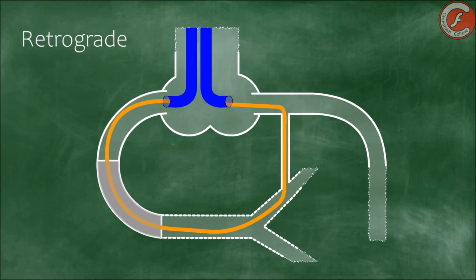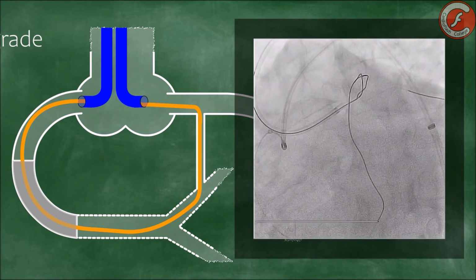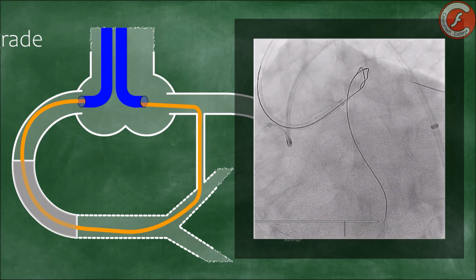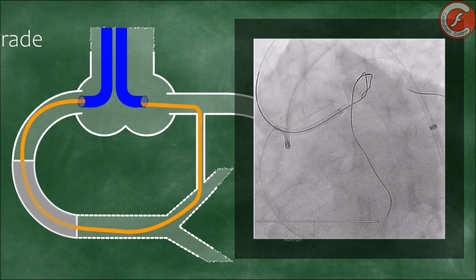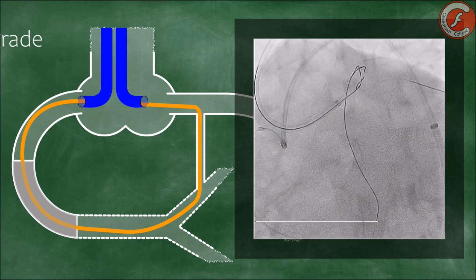In any case, after concluding the circuit with a microcatheter, the guide wire is exchanged for another much longer, or the retrograde catheters are cut out with the purpose of, in both cases, externalizing the guide wire so that the angioplasty can continue antegradely.